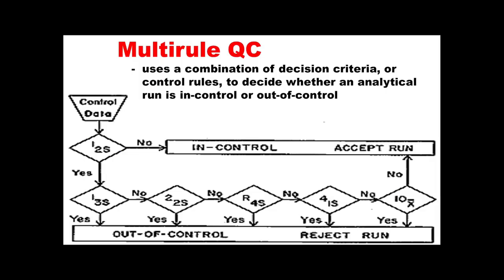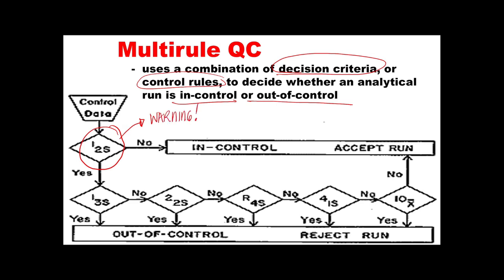Multi-rule QC uses a combination of decision criteria to decide whether an analytical run is in control or out of control. The 1-2S rule is the warning rule — if violated, examine carefully before proceeding. If additional control rule violations are then observed, stop and reject the run; you are out of control and should not report patient results. If only a single 1-2S violation occurs and nothing else, the run is considered in control. The n must be at least 2 to satisfy US CLIA QC requirements.